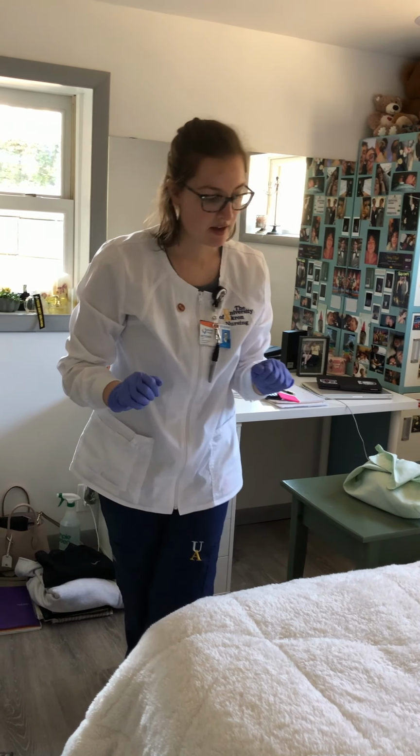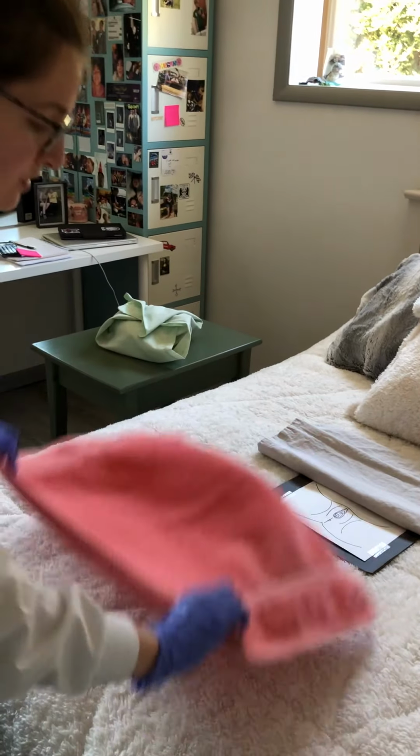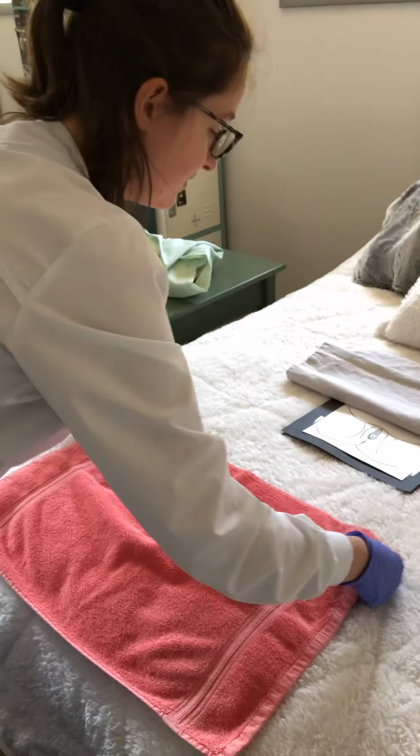Okay, so I have on clean gloves. And what I'm going to do next is go ahead and place a waterproof pad underneath the patient. If this was a real patient, I would ask her to move her buttocks so that I could slide it underneath. But because this is not a real patient, I'm just going to go ahead and lift the cardboard and do that.